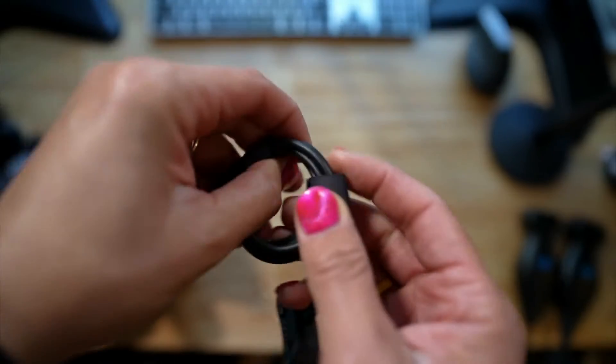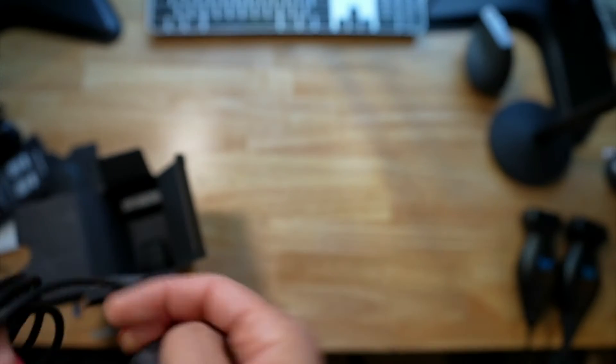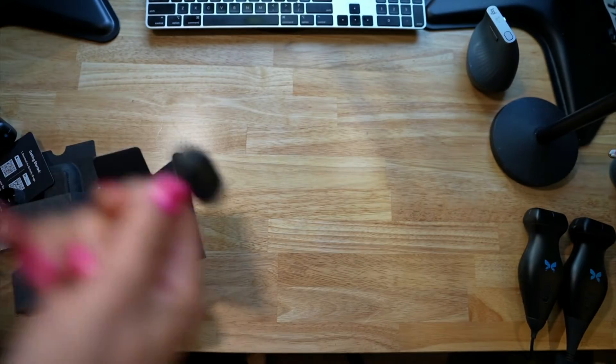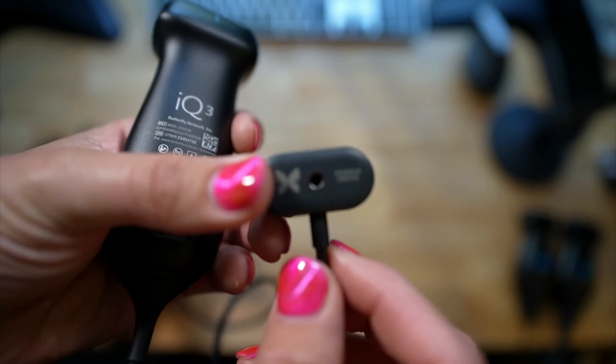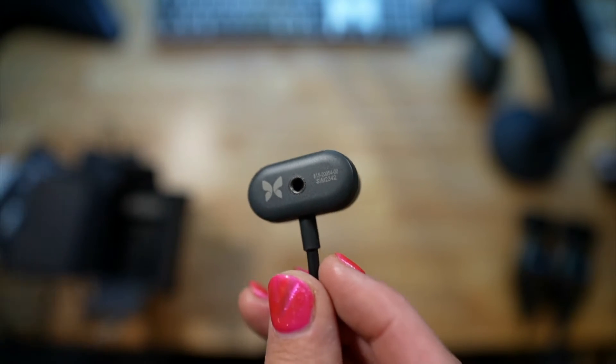Let's look at this. It looks like the probe just kind of goes right in there. And there's a little thing up here which you can presumably screw into something for a wall mount, which is kind of cool.